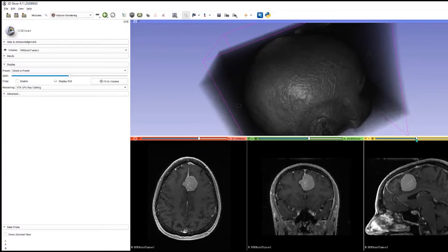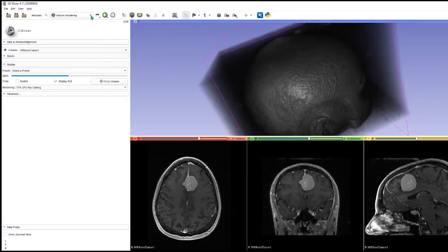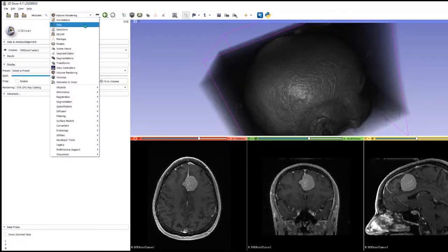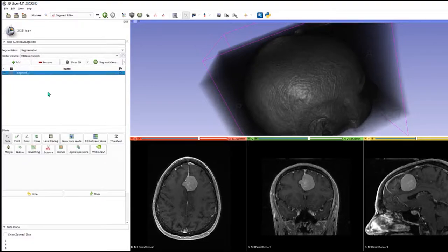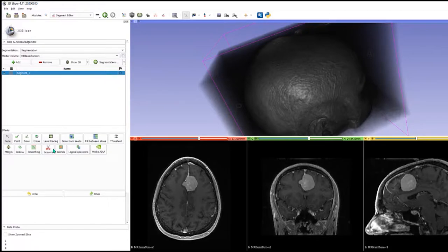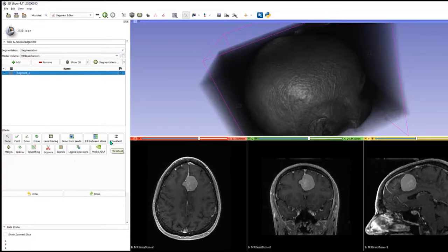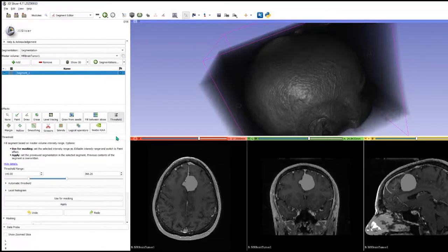Normally the way we would do this would be using the segment editor. I'm going to add a new segmentation and we'll just use a simple histogram method to threshold this.